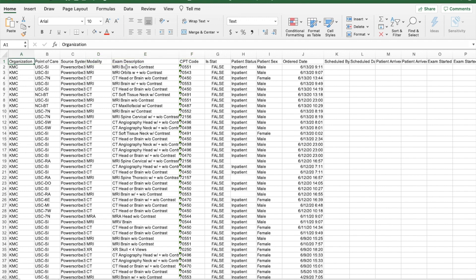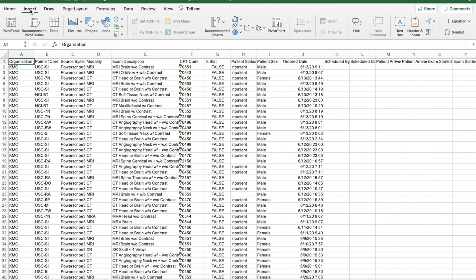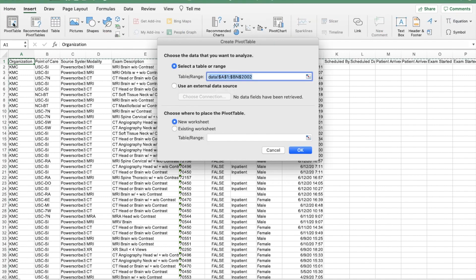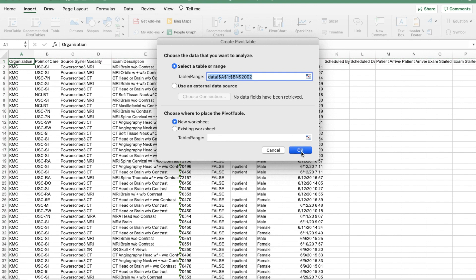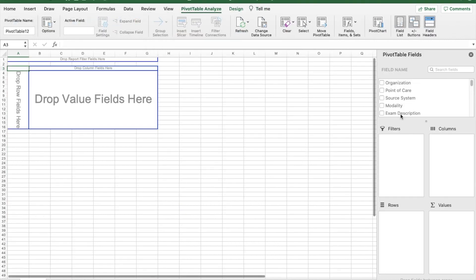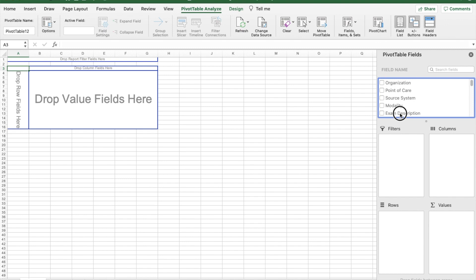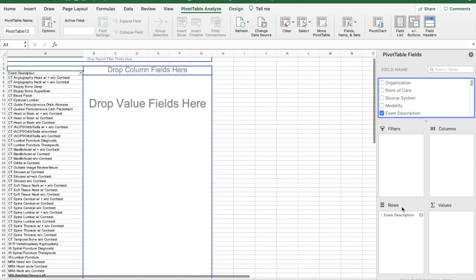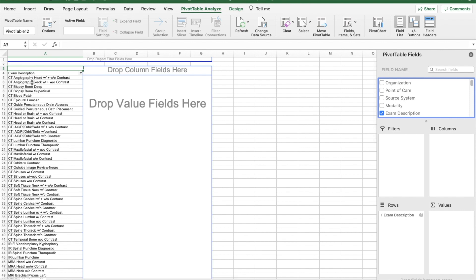To make your case logs, go ahead and click Insert, then click Pivot Table. It selects all the data — click OK. All you have to do is click and hold on exam description and drag it into rows. And as you can see, here is the list of all the exams that I have read.